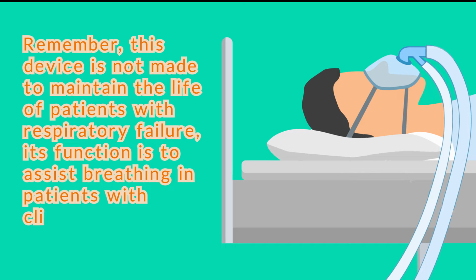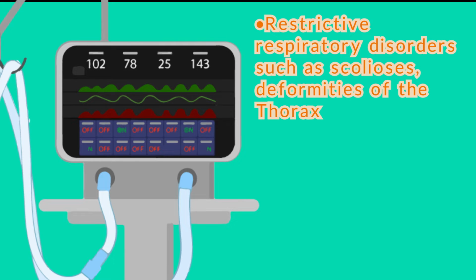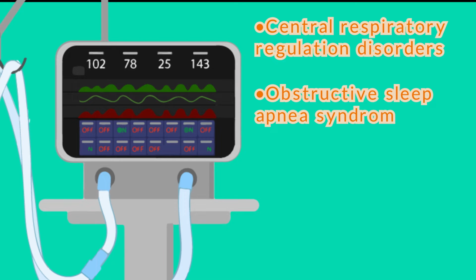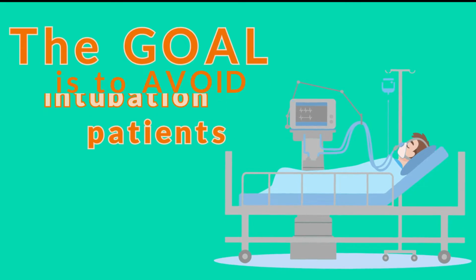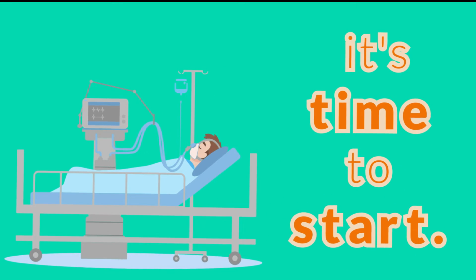Its function is to assist breathing in patients with clinical pictures such as obstructive respiratory disorders such as COPD, restrictive respiratory disorders such as scoliosis, deformities of the thorax, neurological, muscular, and neuromuscular disorders such as diaphragm paralysis, for example, central respiratory regulation disorders, obstructive sleep apnea syndrome, and for ventilatory support to patients with respiratory failure due to COVID-19. The goal of non-invasive ventilation is to avoid intubation of patients, thus reducing some of the complications associated with conventional mechanical ventilation. Alright, time to start.